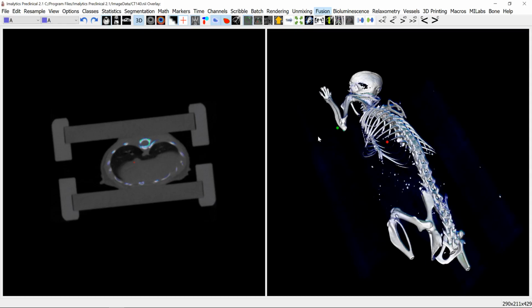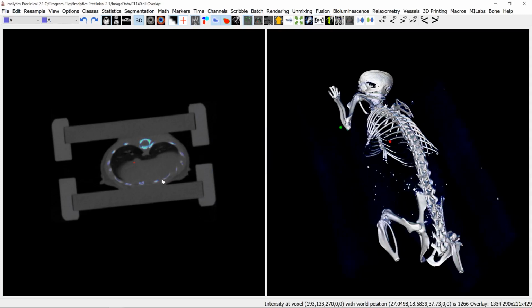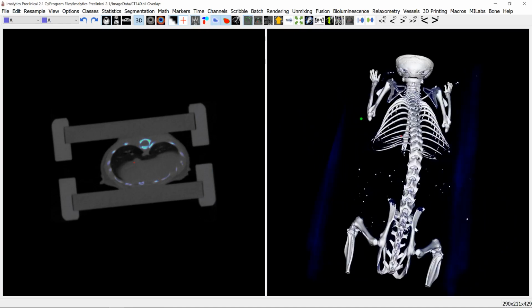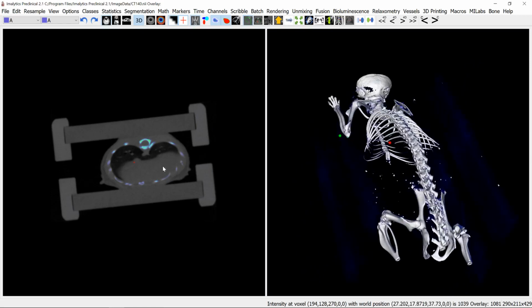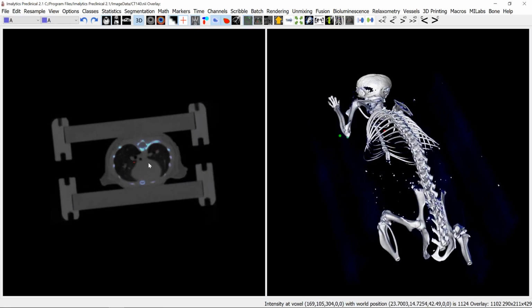It's computing again for a few seconds, and then it will show the residuum. That's even slower, and now the fusion is even better. You barely see the overlay here because it's kind of hidden through the underlay. And here you can see the result of the fusion, so overlay and underlay are now pretty much on top of each other. So what can we use this for?